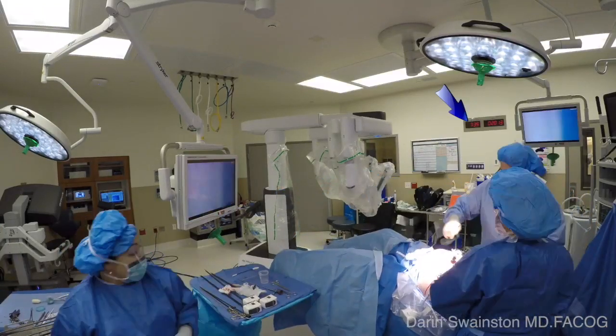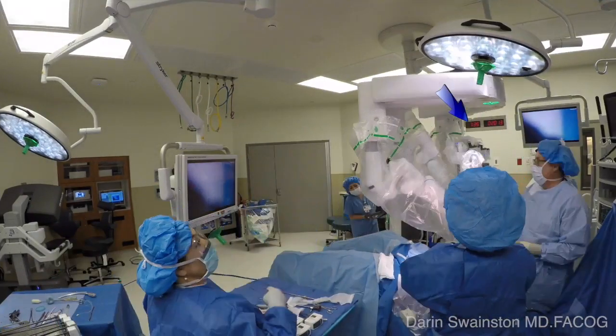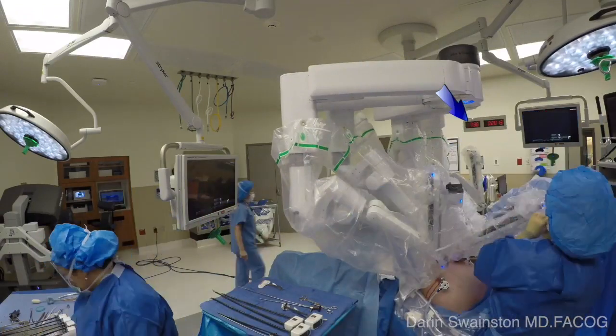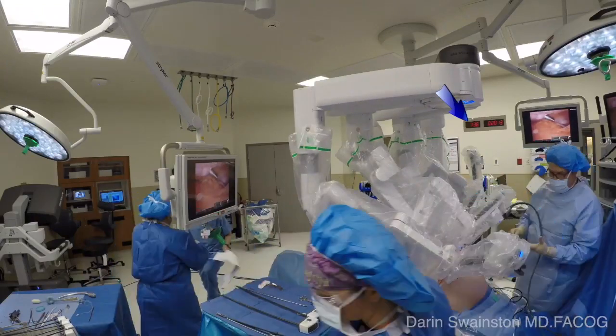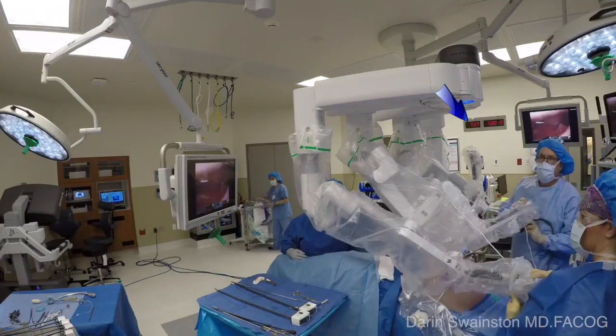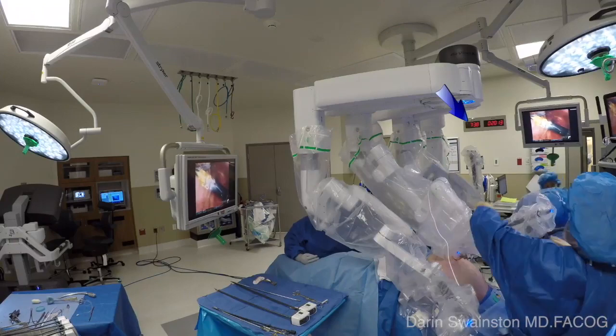Once she brings it in, we'll do the camera first at 7:35 and 45 seconds. Once we put the camera in, we then attach the two other arms and bring the instruments in. This patient even had a midline adhesion that made it a little difficult to bring the instruments around, and still it was done in under two and a half minutes to complete this entire docking and positioning.